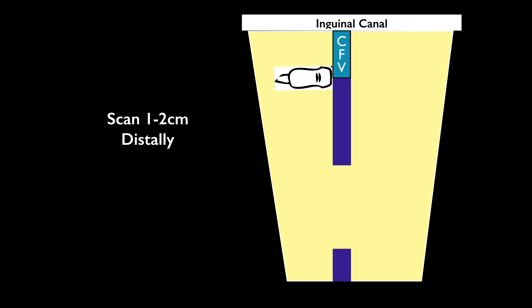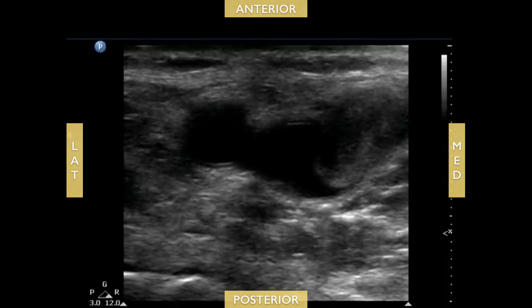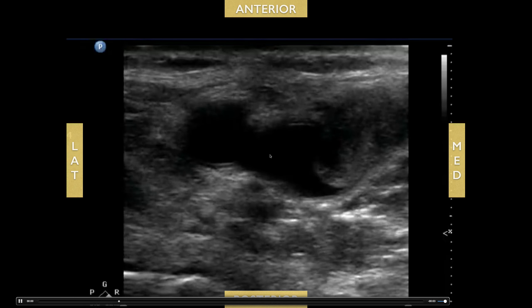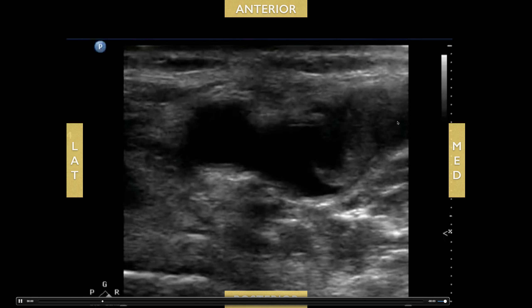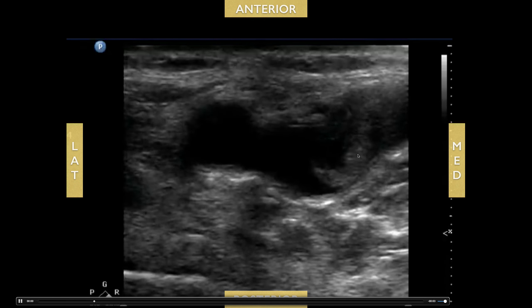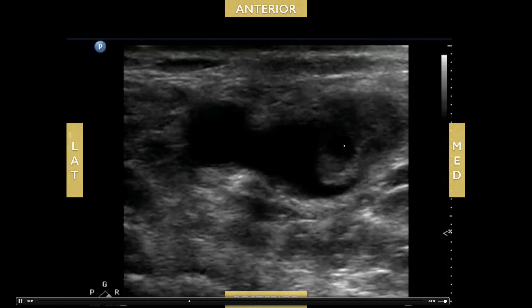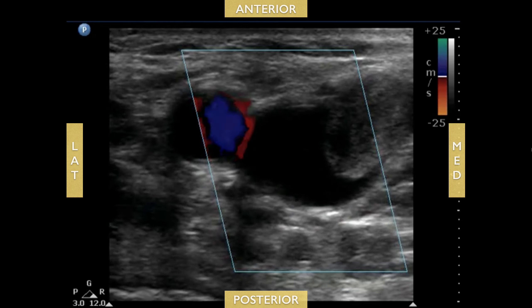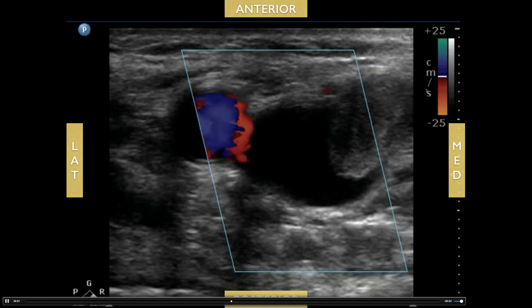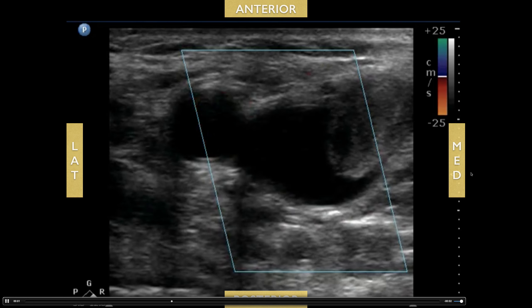As you slide down and look for the saphenous vein coming off medially, here's an example of what we discussed: the common femoral vein, and the saphenous vein as it comes into the common femoral vein. There's a clot within the saphenous vein right at that junction, and you can see it creeping into the common femoral vein. I would consider this a DVT even though it originates from the saphenous vein. With color flow, you can see how large this saphenous vein clot is, encroaching into the common femoral vein.